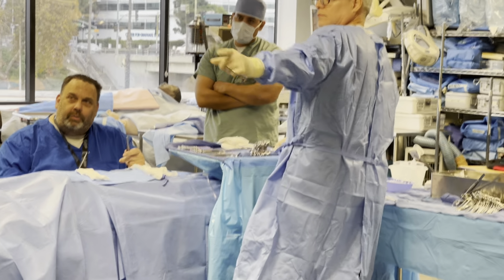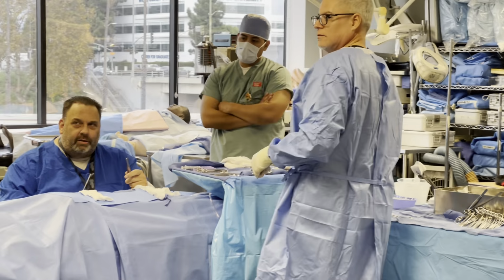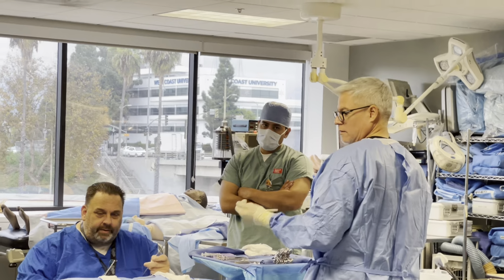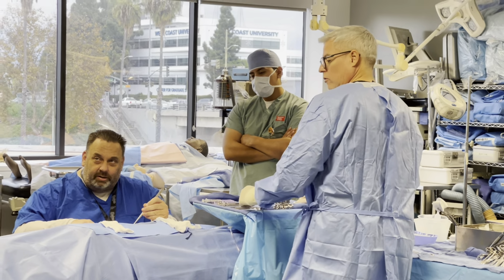For who? The circulator. So with us, you're directing their eyes to where it's working. Where's it working? In his hand, it might be in the cavity, right? So she can't see it, but she knows it's working in the field. So they know to look into the hand area and then they can see it. On the field, they know to direct to the field.